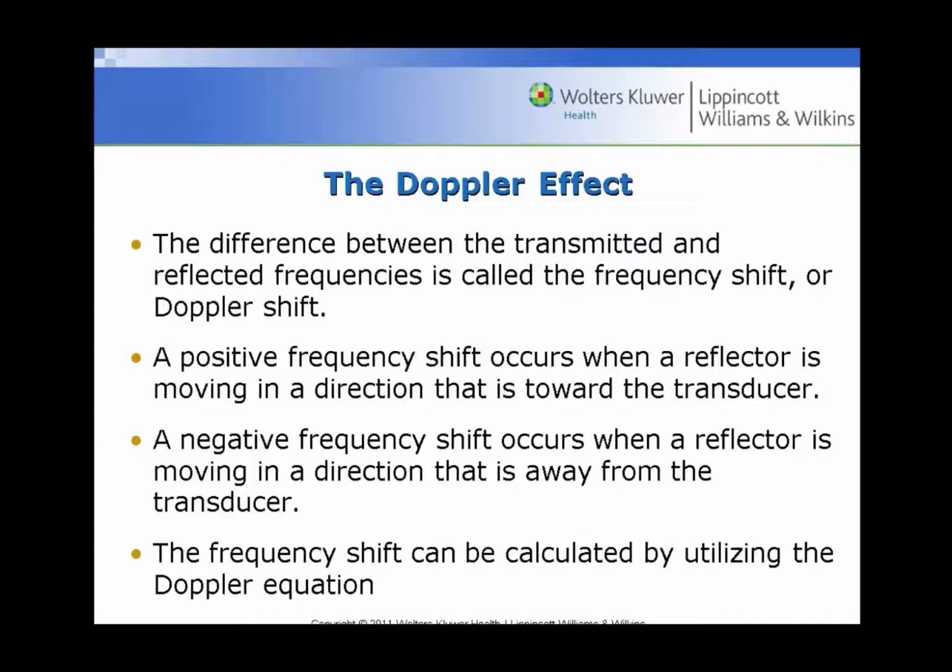One of the acronyms that we can use to remember what our profession prefers as far as the color of the shift would be BART, meaning that blue is away from the transducer and red is towards the transducer. So that is how our ultrasound community would like the colors to be reflected.